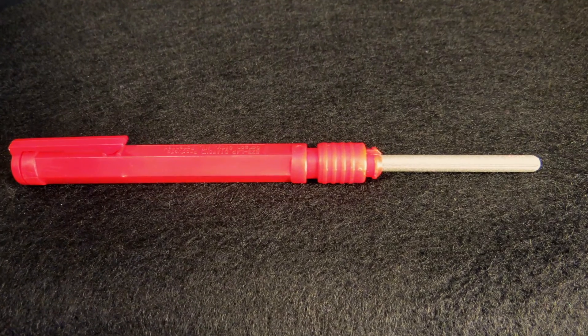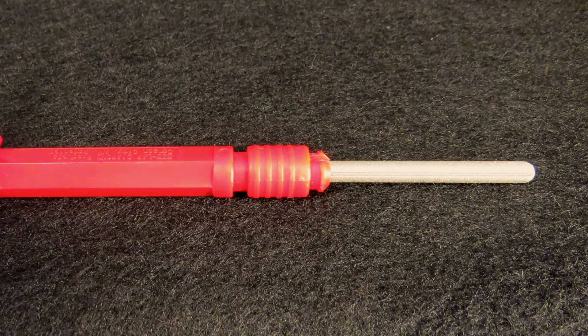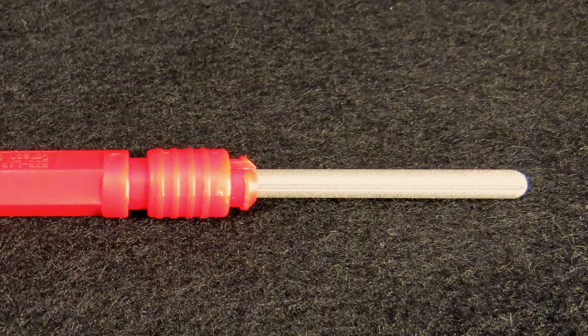Point File: This file has a slot running its length and is used as the first step to sharpen or restore the shape to the points of skin hooks, rake retractors, towel clips, and other sharp pointed instruments.